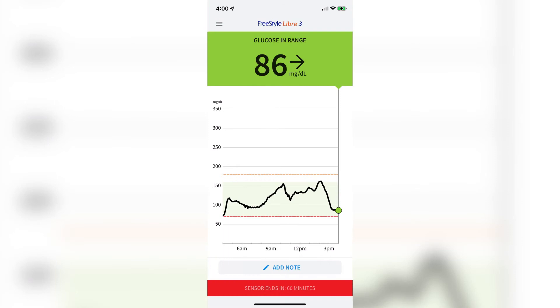After wearing it for at least 12 hours, this is what you'll see in the app — your actual blood sugar as well as a 12-hour overview. When the two weeks are over, simply peel off the sensor and apply a new one. Remember to rotate where you place the sensor; rotating between arms makes a lot of sense.